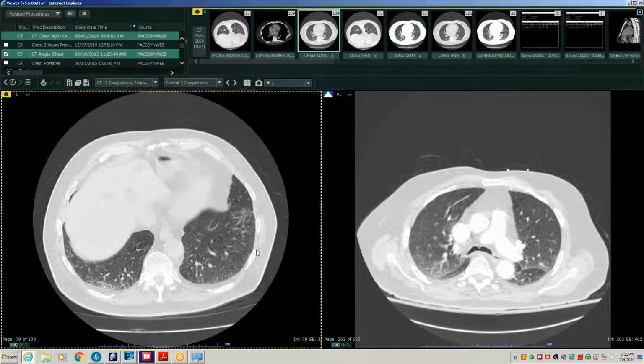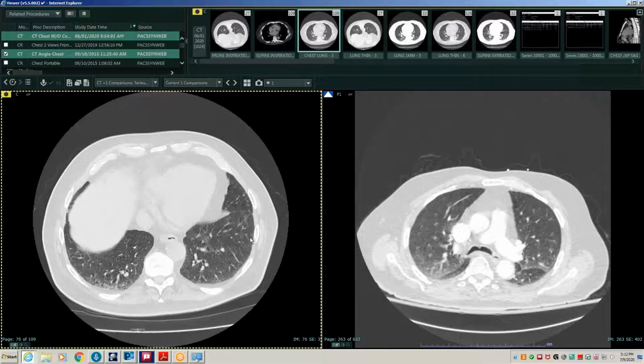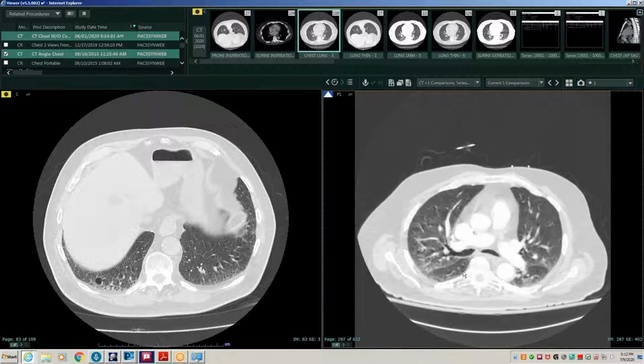So Lucy, from what I'm seeing, I see a few cysts that are discrete from the ground glass and other stuff. There was one or two in the bases, but usually with LIP, the cysts are pretty thin walled, basal predominant, and perivascular in distribution. And you can see ground glass, like that one. Yeah, that's a good example of an LIP cyst. But these smaller little holes, I agree with you in some ways, look a lot more like smoking-related stuff. And the other thing, you don't have to have nodules with LIP.